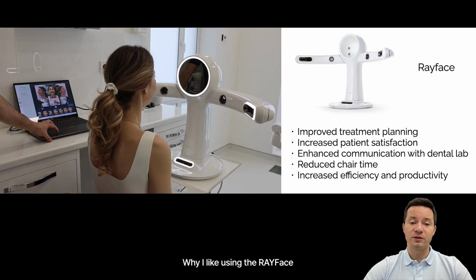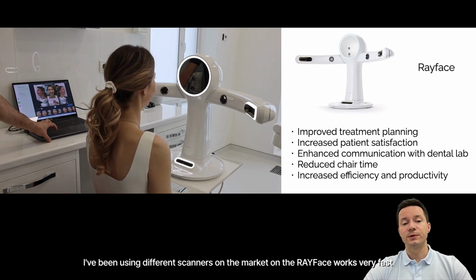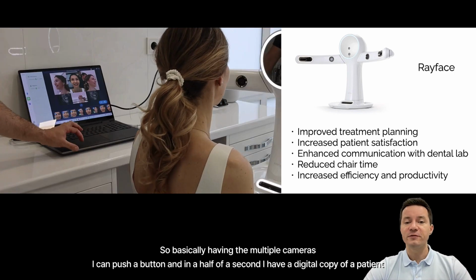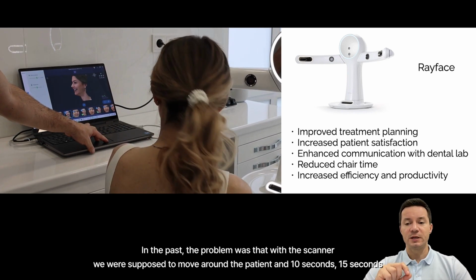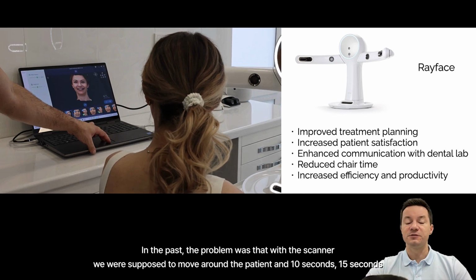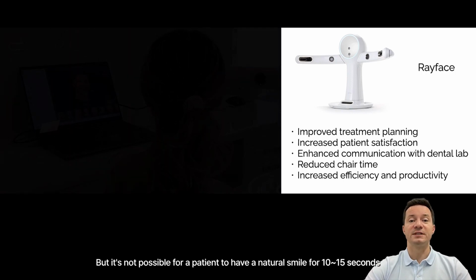Why I like using the Ray Face, I've been using different scanners on the market. The Ray Face works very fast. So basically having the multiple cameras, I can push a button and in half of a second, I have a digital copy of a patient. In the past, the problem was that with the scanner, we were supposed to move around the patient 10 seconds, 15 seconds, but it's not possible for a patient to have a natural smile for 10, 15 seconds.